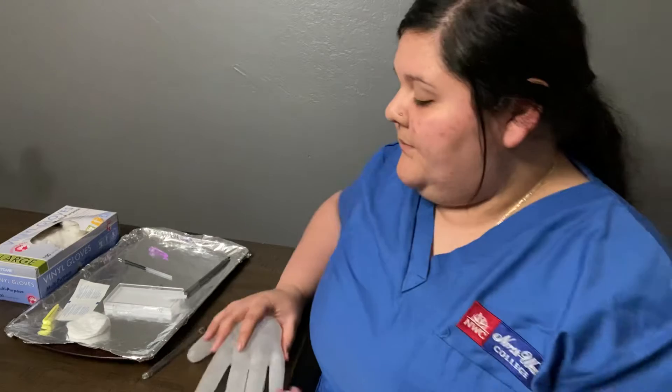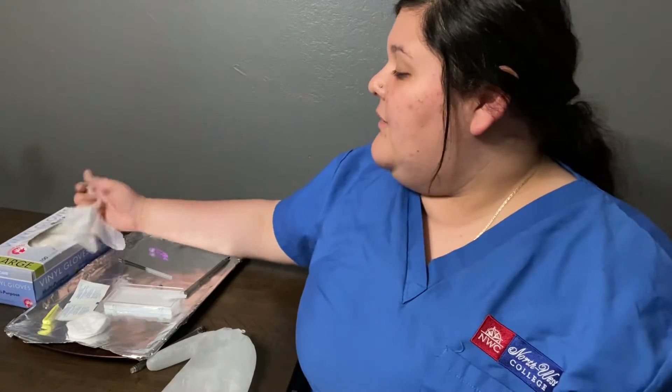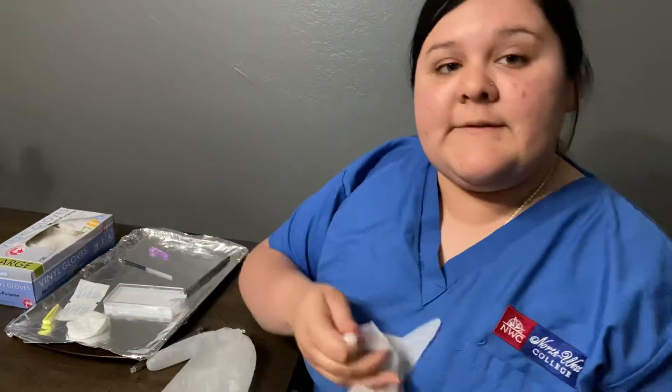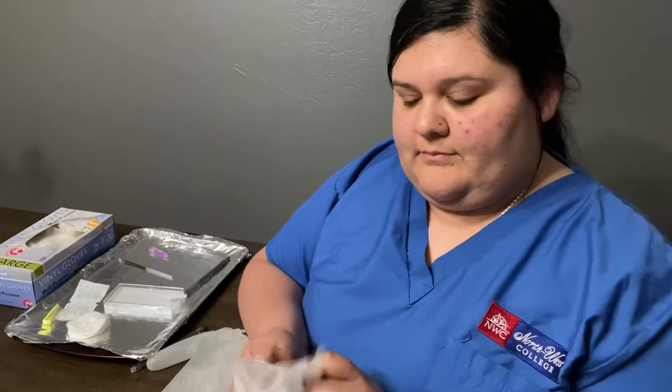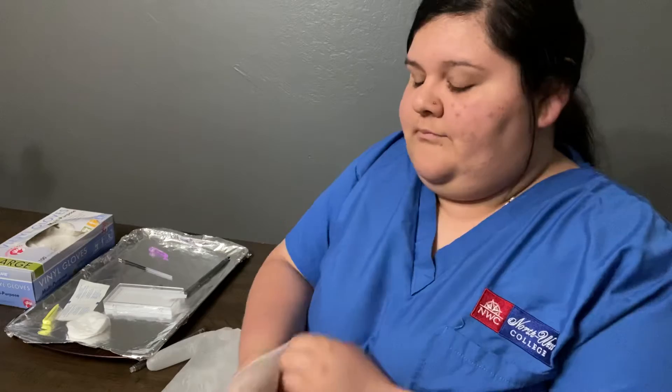So then I'm going to go ahead and show you. First, I'm going to want to make sure that my hands are washed — and they've already been washed — and I'm going to want to verify who the patient is. Once I do that, I'm going to want to put on my pair of gloves.